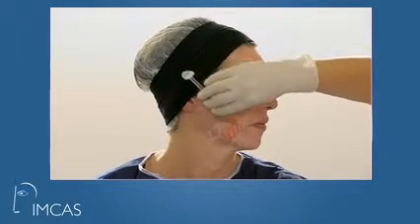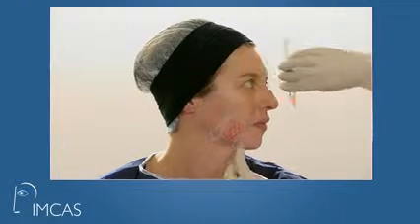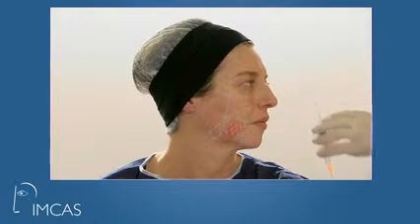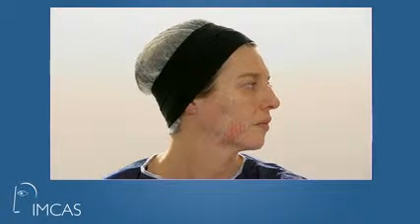I will use the fan shape technique, like we saw before, of course, and bolus technique, for example, and particularly into the notch. We will go until the chin to enhance a little bit the harmonious line of the contour.